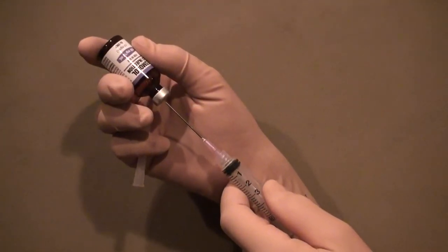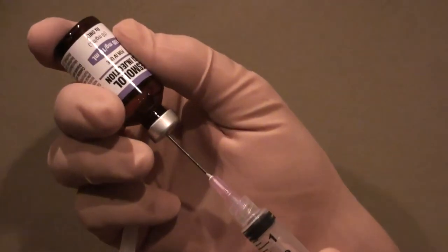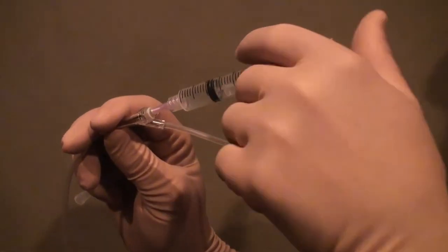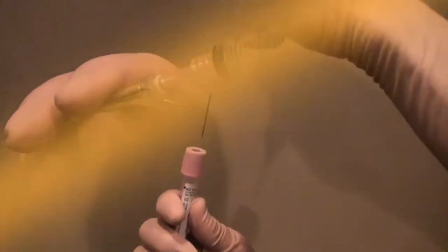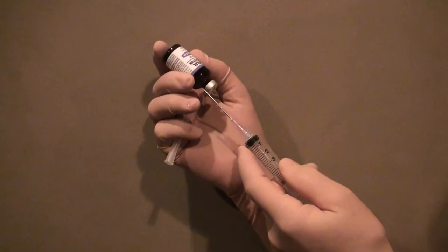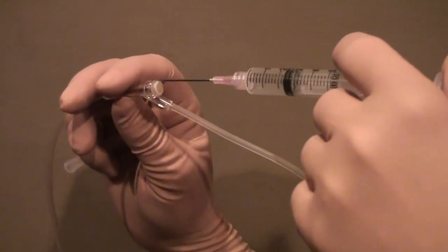MedMate dramatically reduces the needle stick injury risk due to its innovative guarded needle design. Before we demonstrate MedMate, let's review how these activities are currently performed and the risks therein entailed. Needles are used in clinical care to withdraw medications from vials, inject medications into IV ports, and transfer biological specimens. The slightest lapse in concentration can lead to a needle stick.